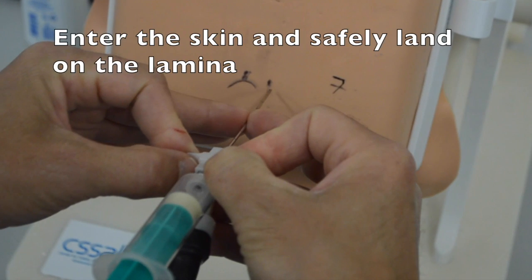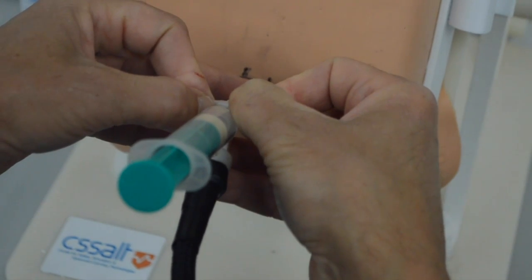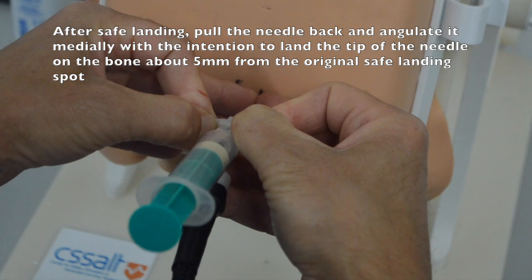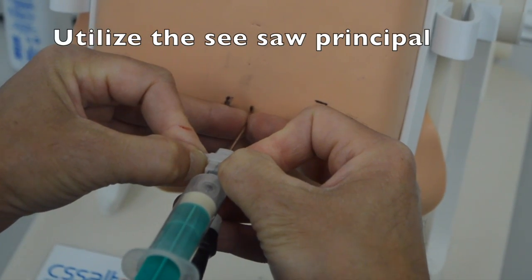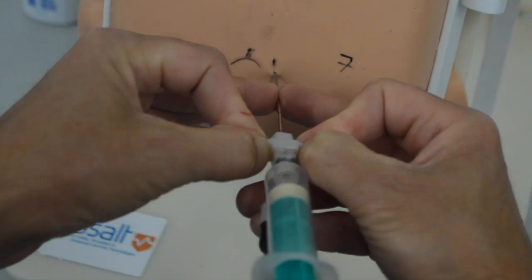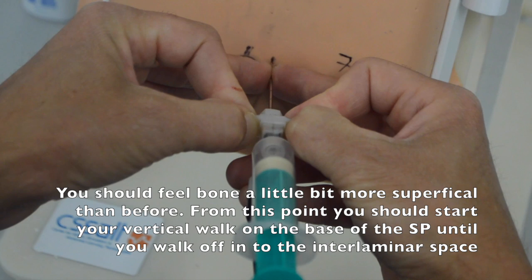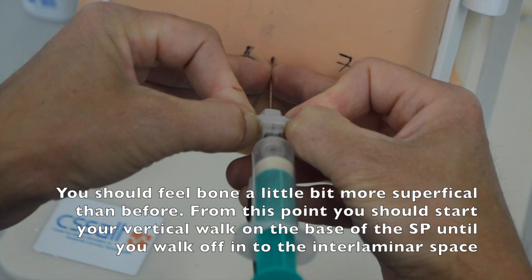First, enter the skin and safely land on the lamina. After safely landing on the lamina, pull the needle back and angulate it medially with the intention to land the tip of the needle on the bone about 5 mm from the original safe landing spot. You should feel bone a little bit more superficial than before. From this point, start your vertical walk on the base of the spinous process until you walk off into the interlaminar space.